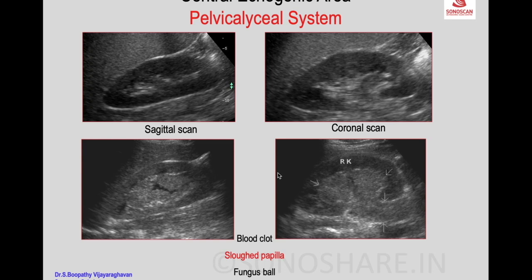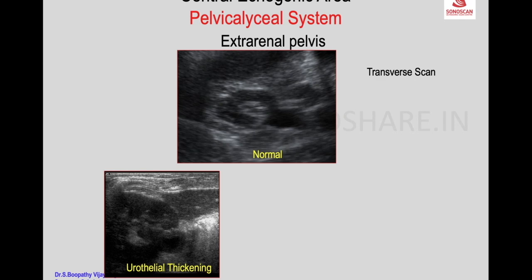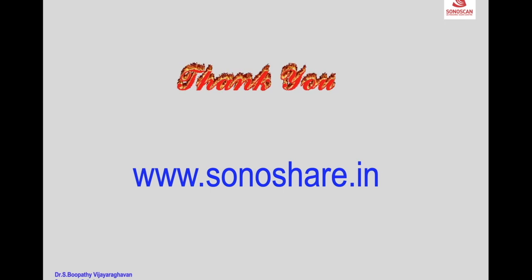The extrarenal pelvis is a normal variation where the renal pelvis is mainly extrarenal in location and, lacking the support of parenchyma, becomes baggy. This is appreciated on transverse scan: you see the extrarenal pelvis with thickening of the wall. In PUJ obstruction you see a hugely dilated extrarenal pelvis while the calyces are not much dilated, because pressure is taken up by the extrarenal pelvis. Thank you very much for your attention.